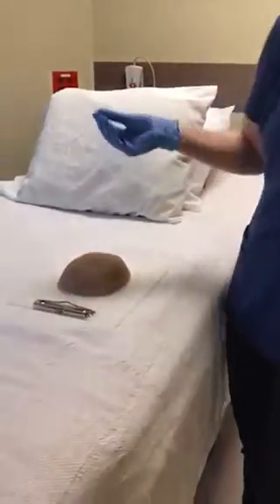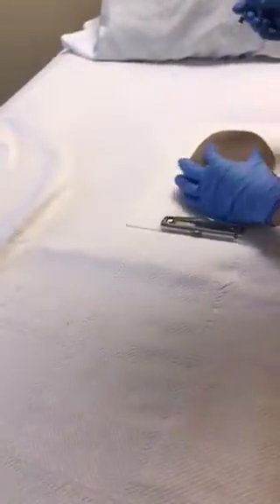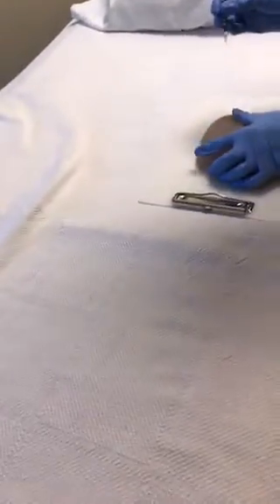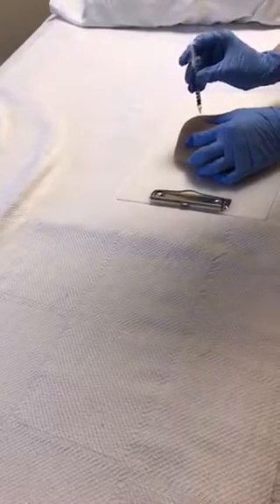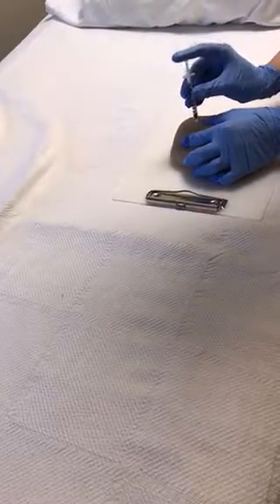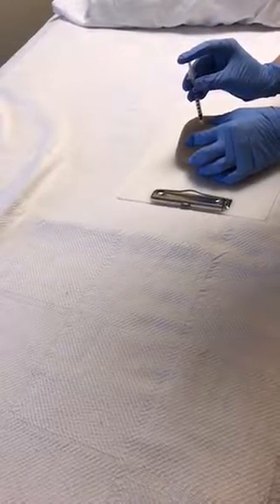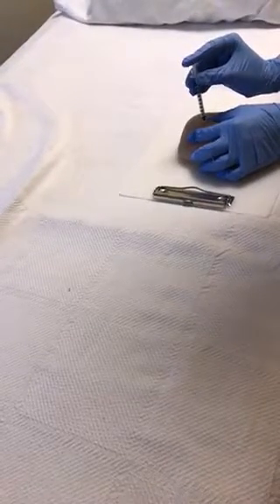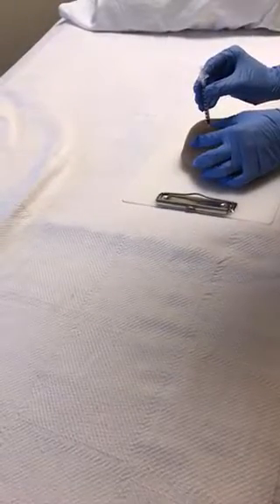Okay, so I'm going to get rid of that cap there. I'm going to pinch Bob's skin up a little bit. I'm going to move Bob this way a little bit. So I'm going to pinch that little fat roll on the left side of his abdomen here. And then I'm going to administer it at 90 degrees, push that syringe and inject that over 5 seconds. Perfect. We're going to pull that out slowly.